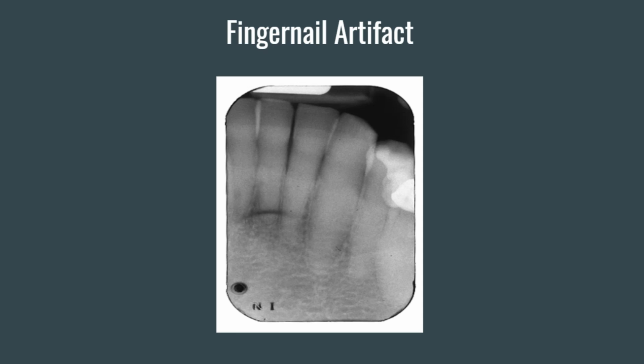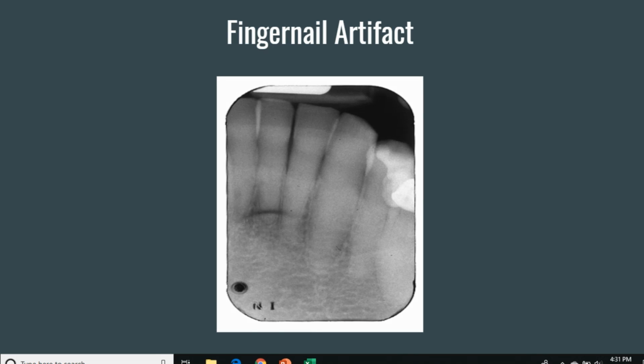And here we have a fingernail artifact. Right above that, that little black sort of crescent moon, that's caused by a fingernail. And this has caused the film emulsion to be damaged. So maybe someone who has big, thick acrylic nails or just really long nails in general squeezed a little too hard on the film and scratched the emulsion off.